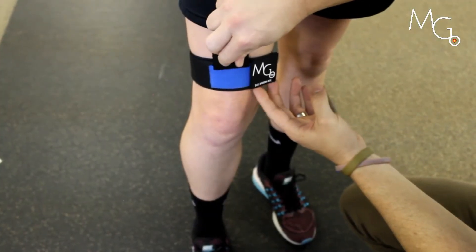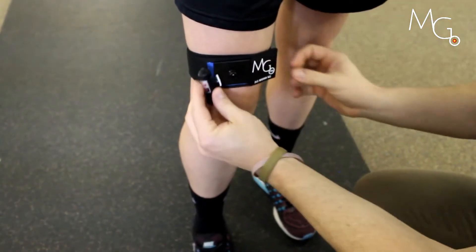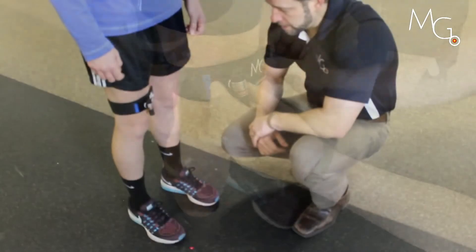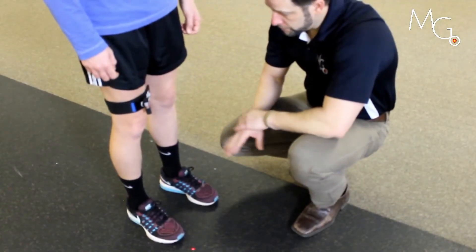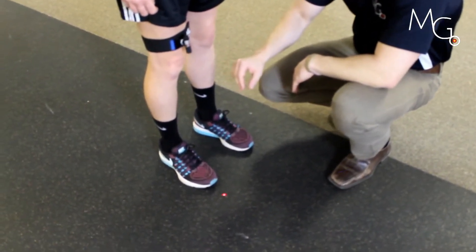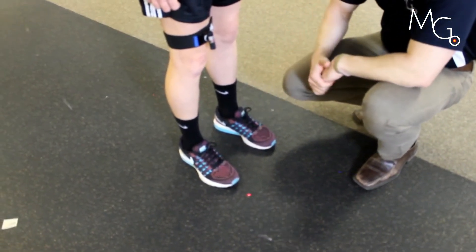Use the flat mount to slide into the blue field and then we can attach the laser. The laser will not move onto the shoe if the knee does not move back into extension. So she can tighten her quad and not move back into extension, the laser will not move.